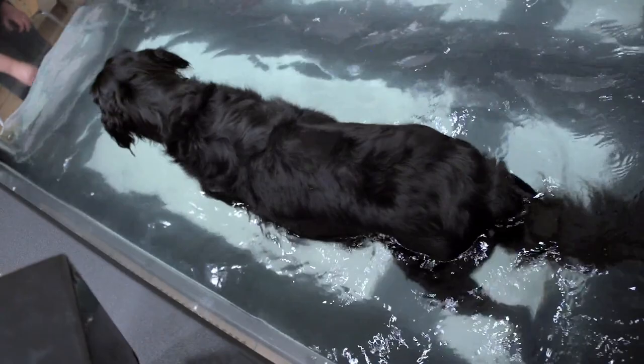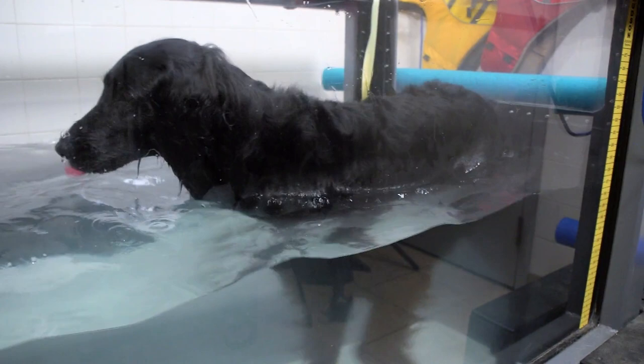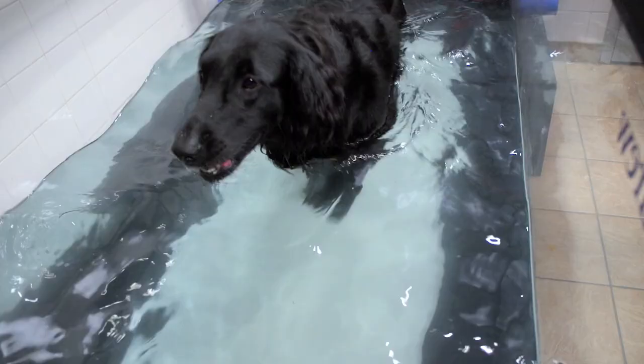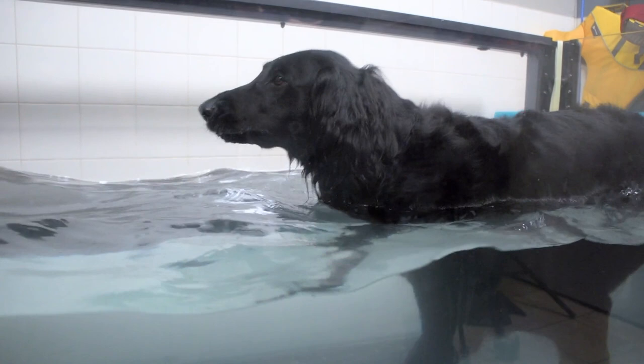Dogs that don't even have any ailments can benefit from hydrotherapy just for conditioning purposes. The buoyancy and resistance of the water means they recruit their muscles a little bit differently, so it gives them sort of a cross-training effect. We're seeing more and more cases on a preventative basis where people are just starting to notice their dog is slowing down a little bit, so they bring them in while they've still got a lot of muscle mass that we can preserve.